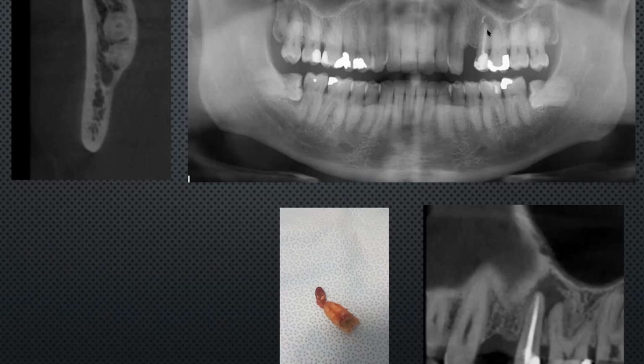Depending on the implant company, the drill bits go to different maximum diameters for the diameter of the implant. Depending on the system I'm using, I might over drill a little bit to make sure that I'm not overly compressing the bone as the implant is placed. I don't like to finish off my implant placement with the hand wrench. I like to place it at a maximum of 50 Newton centimeters with the implant motor. If I'm having to really torque it down, that makes me really uncomfortable. If I feel that's going to happen, I tend to stop, back out the implant, and then re-drill.